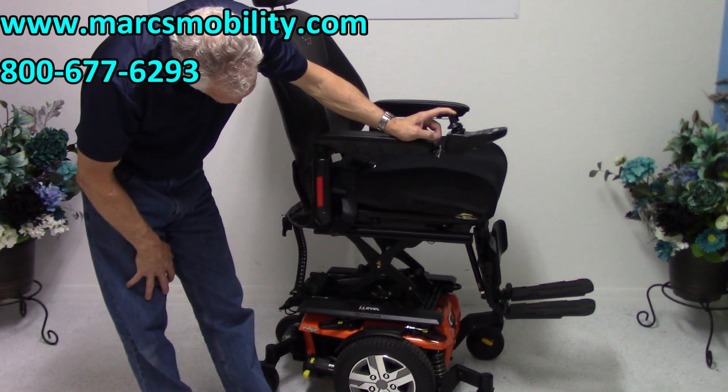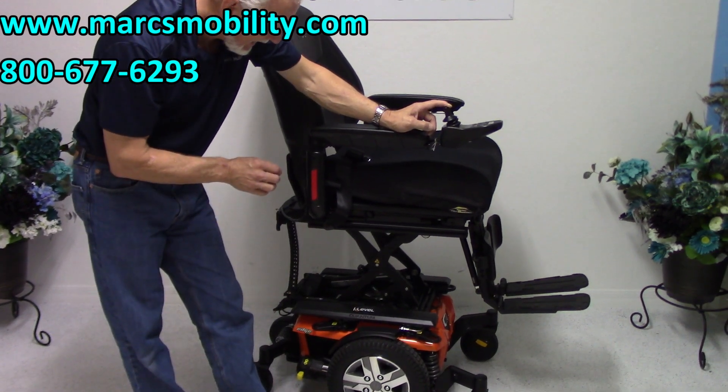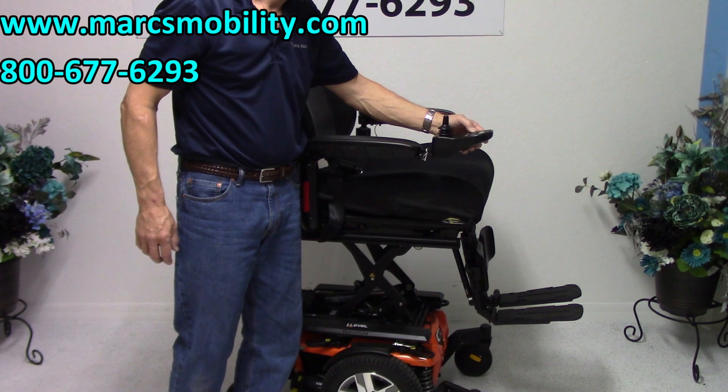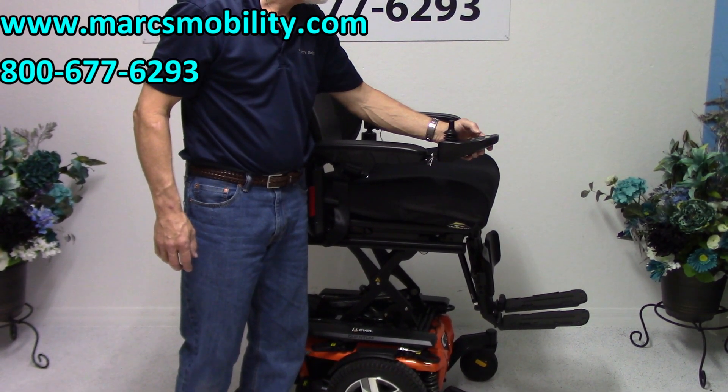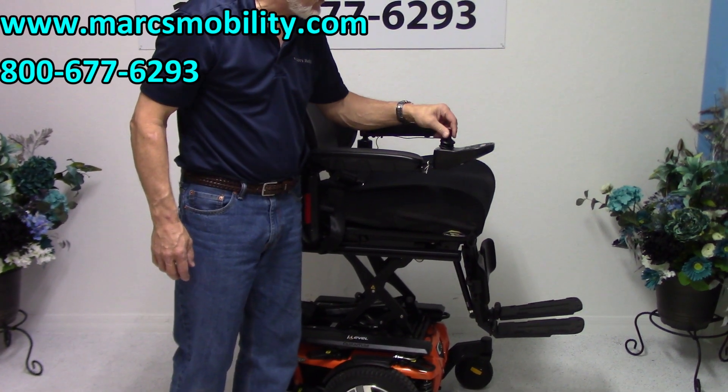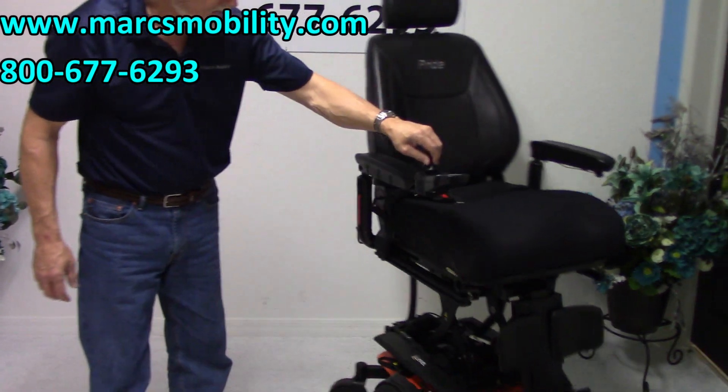So this is all the way up now almost. The nice thing about these I-Levels is that when the seat is elevated, you can put it back in drive and still be able to drive the chair with the seat elevated.